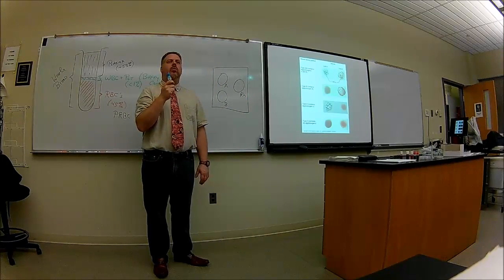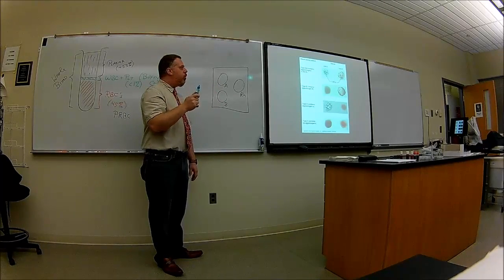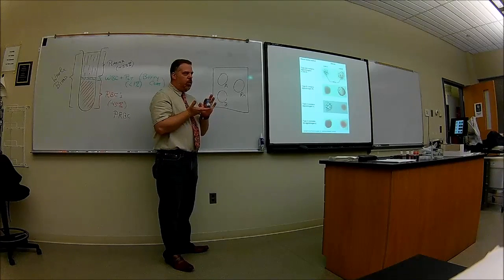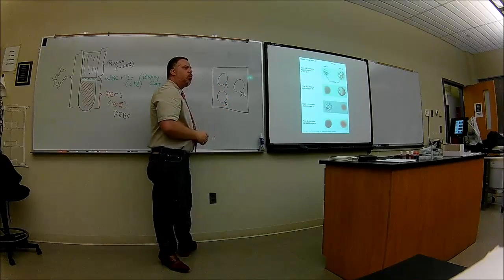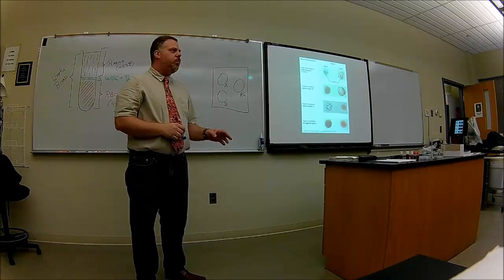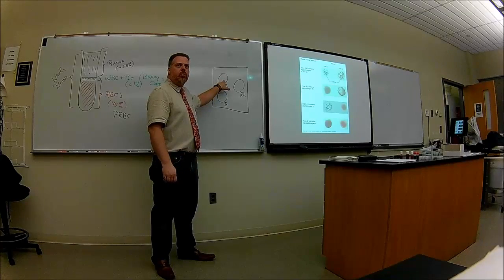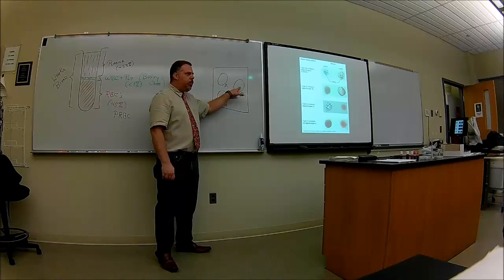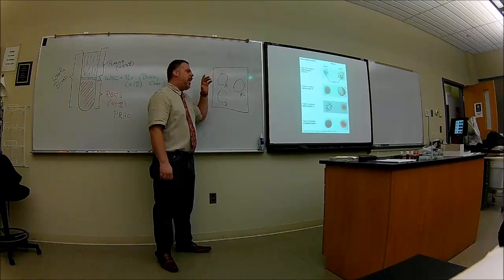And what we're going to do, not now, because it'll dry up if we do it now, but when we're ready, we're going to put 3 drops of this serum, so to say, into the well of A. What we're putting in the well of A is antibodies to A. We're putting those little Y's in there. You'll also put antibodies to B in here and antibodies to RH. But let's just consider this one over here. So right now you have 3 drops of just antibodies there.